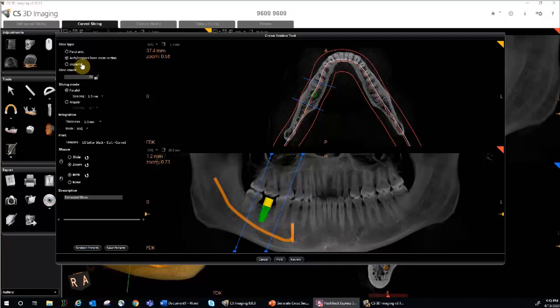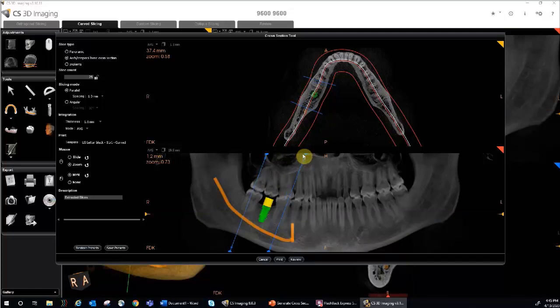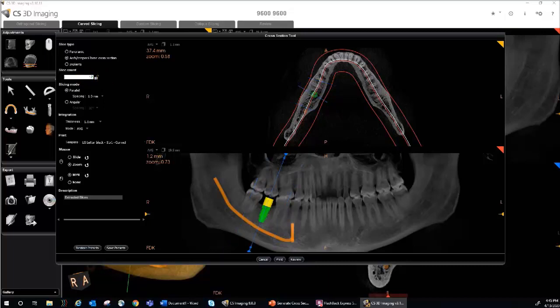Next, left-click and drag the dotted blue lines in the region of interest views to set your region boundaries. In this case, I'm going to select to go around an implant. Your slice count depends on the defined region of interest, but can be modified. So instead of 28 slices, perhaps I only want to display 12. Notice how much smaller the region of interest becomes.